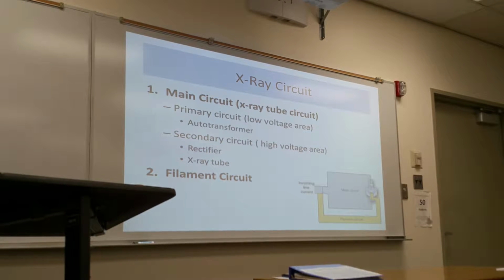The main circuit can be subdivided into two different areas. One is called the primary circuit and the other called the secondary circuit.